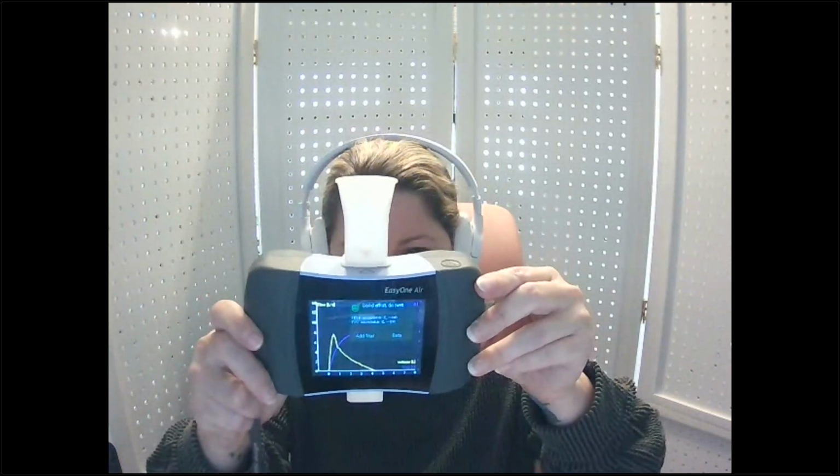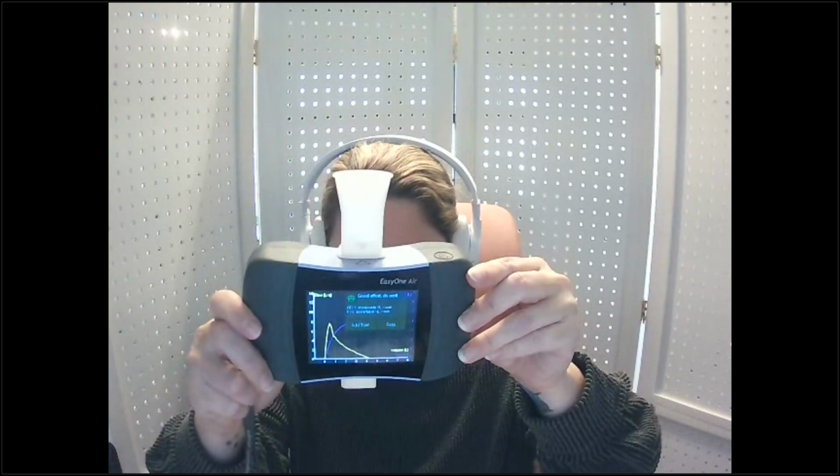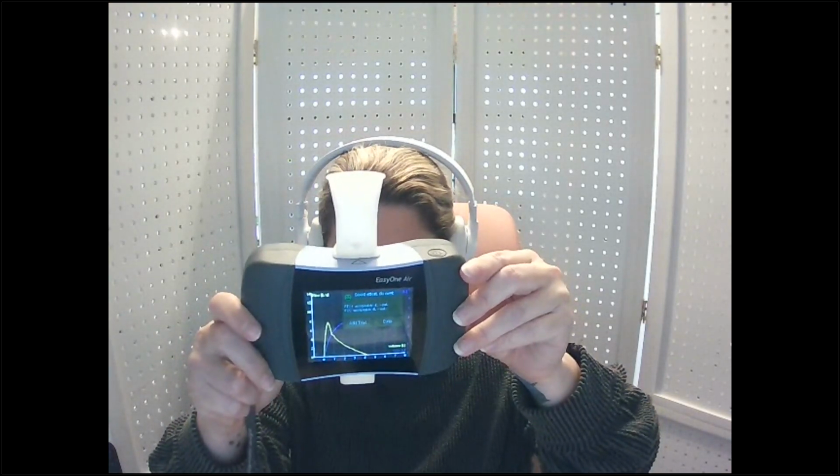But between each trial, you are going to get coaching feedback from the device. Mine right now is saying good effort, do next. And it's also giving me these overall session quality of both the FEV1, so how much air I got out in the first second, and the FVC, how much air I got out overall.